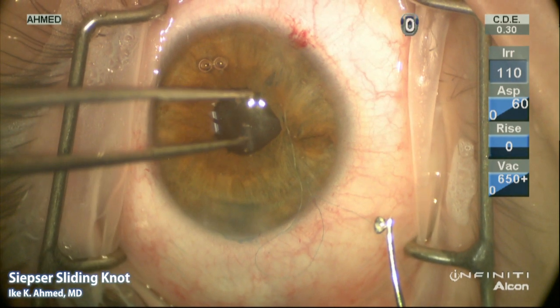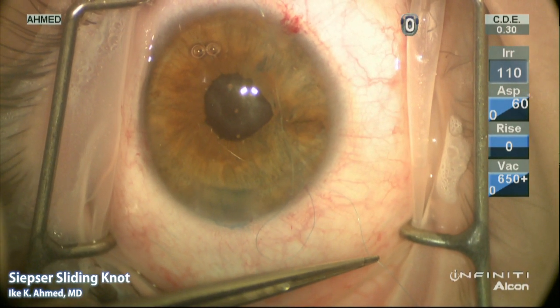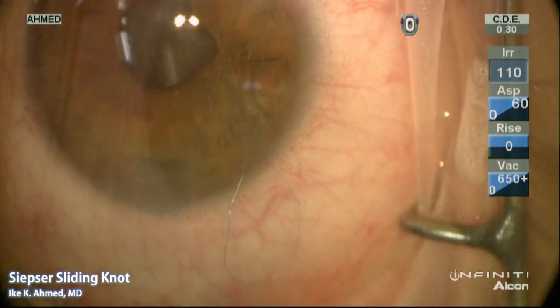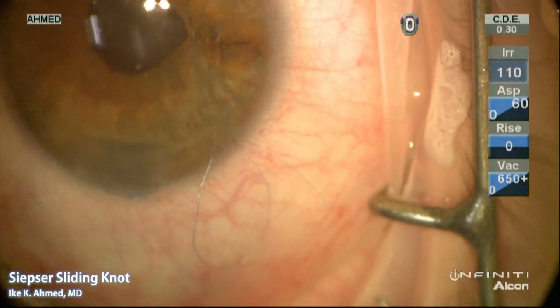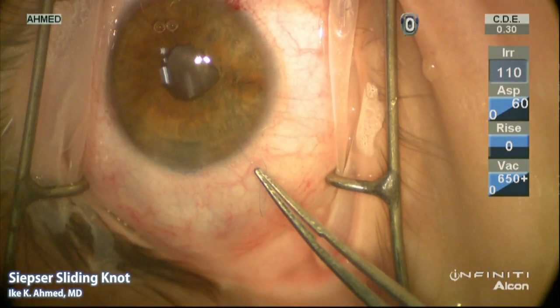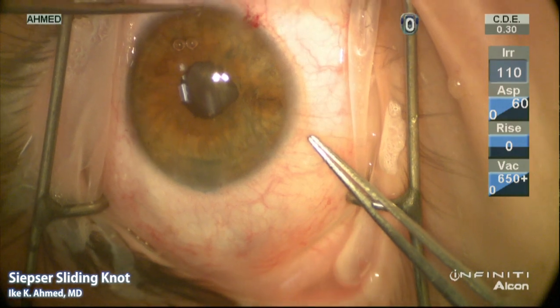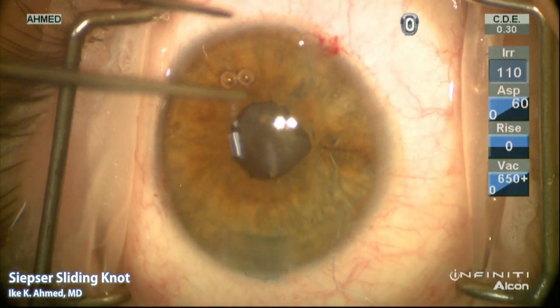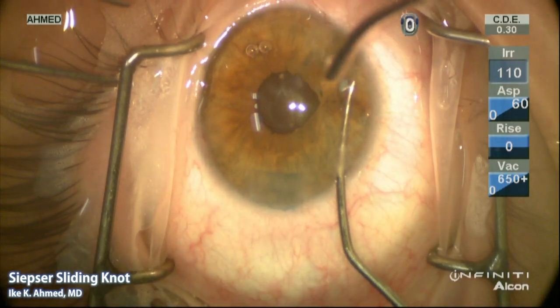At this point the distal loop is identified. You can see the distal strand is pulled here to show the continuous nature of suture number one. The proximal strand is cut short to allow for easy grasping as the suture is tied. The distal loop is grasped with tying forceps and a triple throw is made, looping the curved tier three times and then grasping the proximal strand, pulling it through the distal loop. The distal loop is then pulled to slide the knot along the proximal strand.